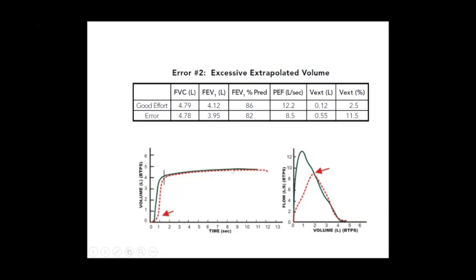On the flow volume curve, you can see here that instead of the patient exhaling from zero until he reached the peak expiratory flow, the curve on your right hand and the dotted red line become submaximal compared to the normal maneuver that the patient should perform.